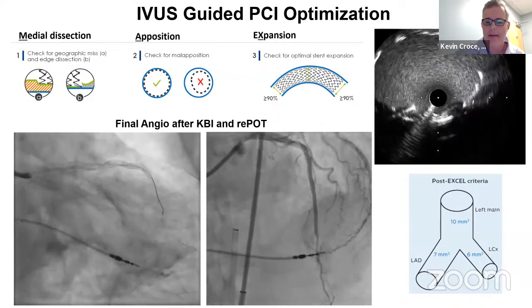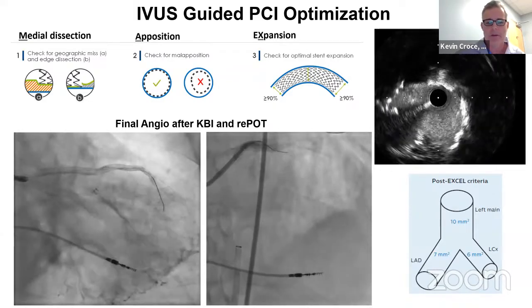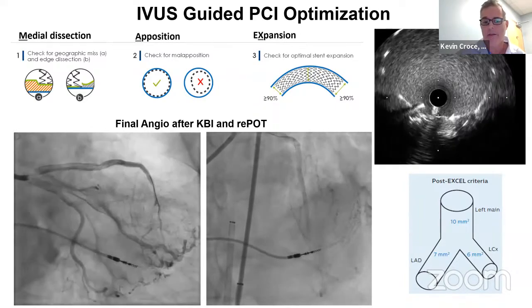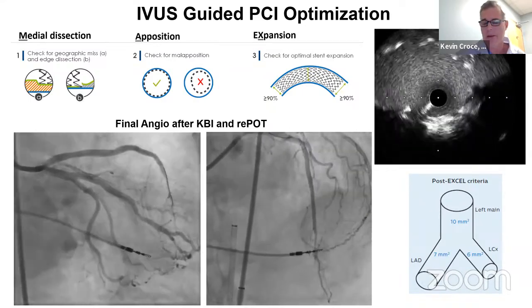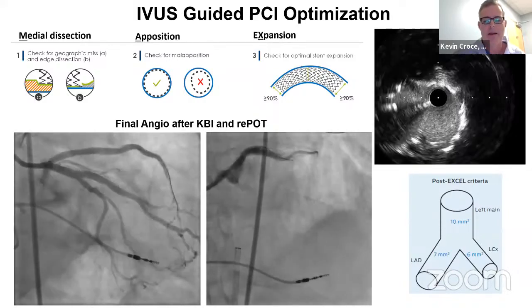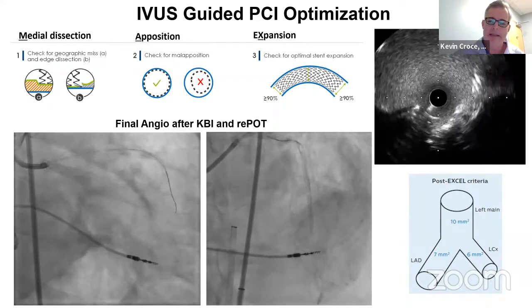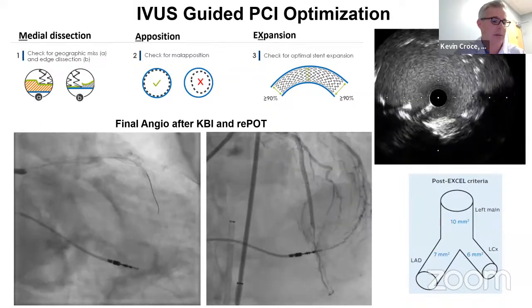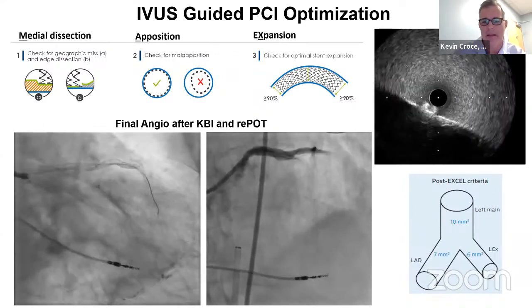And so I think Akiko's inkling is right. If you use a better scaffolding stent in that situation, potentially with better radial strength, you get better outcomes. I've had a nodular calcium that I've modified with IVL that made a Megatron fold on itself at acute implant. I put a second Megatron in and it held it open, and to date the patient's doing okay. But you bring up a relatively substantial pain point with these: our current devices and our current atherectomy tools don't always get enough compliance change that we're able to get good expansion even at the outset, or, if the patients come back later, we see that they fold.